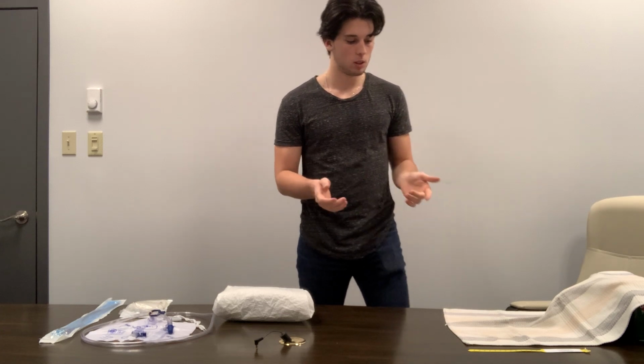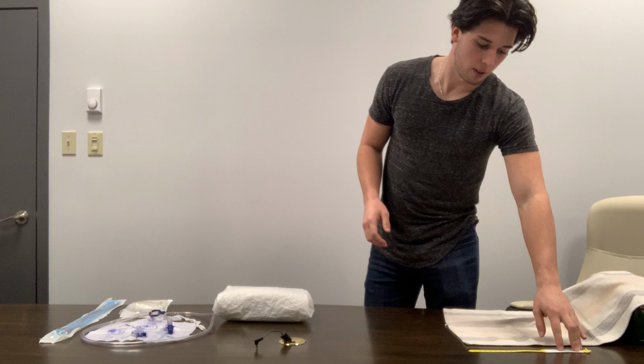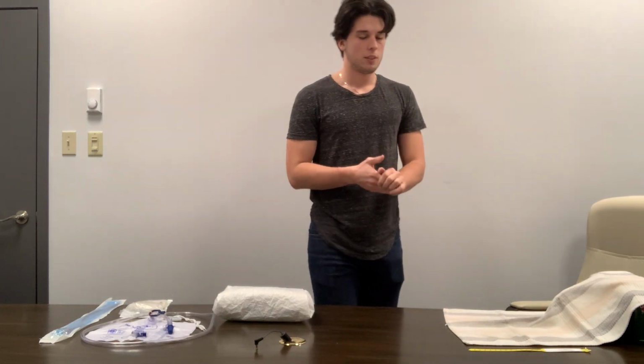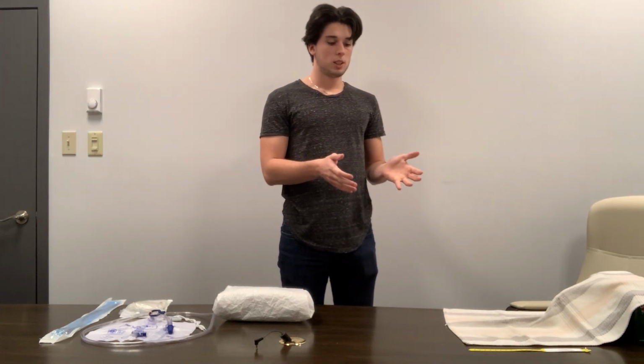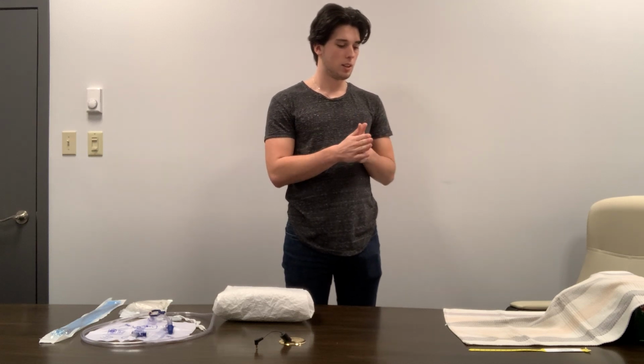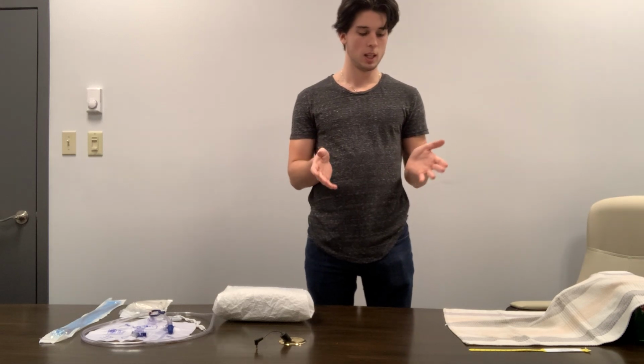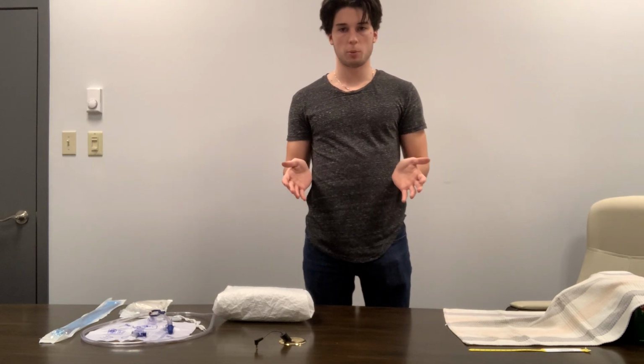and then ask if it's all right if I see their armband. So I'm going to look at their name on their armband here, Jake Nursing, as well as their date of birth, January 1st, 1960. And once I check that, I'm going to ask them if they could verbally state their name and their birthday to me. So they're going to say Jake Nursing and their birthday, January 1st, 1960. And once they state that to me, I'm going to explain to them the procedure that we're doing.